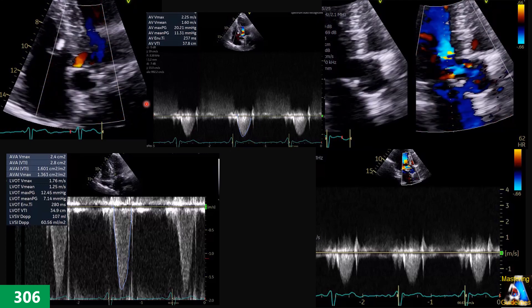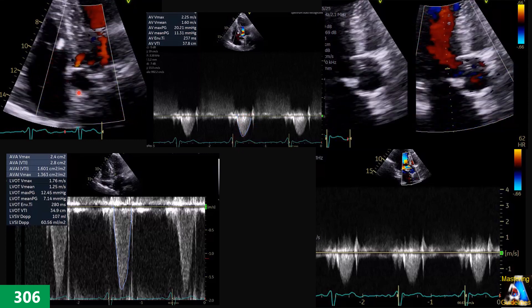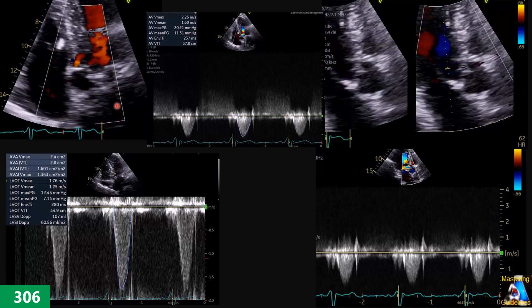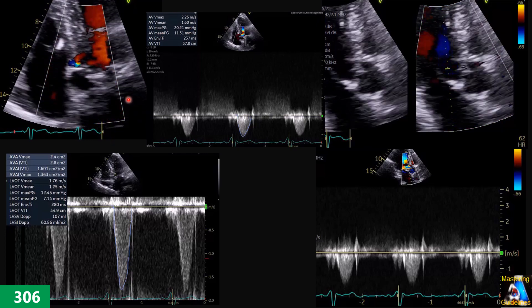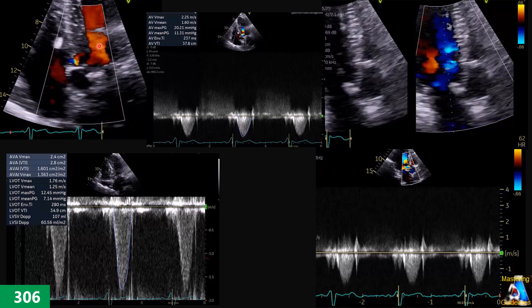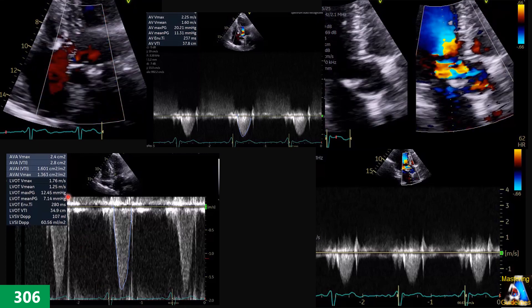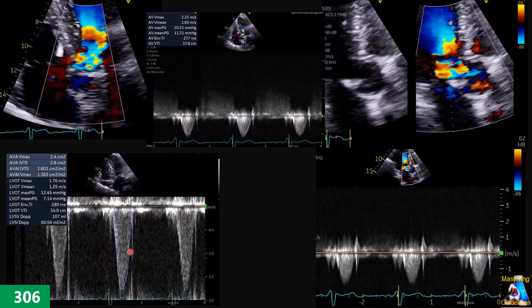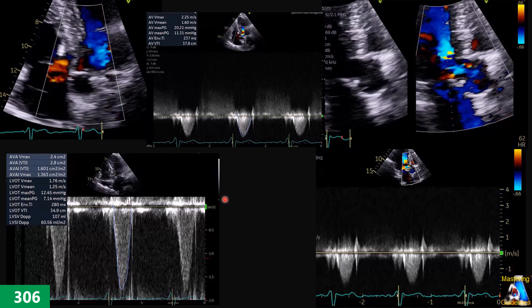At the apical 5, you can see it is almost the same, even a little harder to obtain in this view. You can differentiate which signal belongs to the aorta and which belongs to the LVOT. When we put the sample volume at the LVOT at the area of turbulence or aliasing, we get almost close to 1.8 meters per second maximum, and a VTI measurement. So that is not too high — just a little increased.